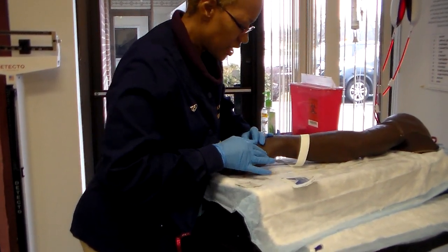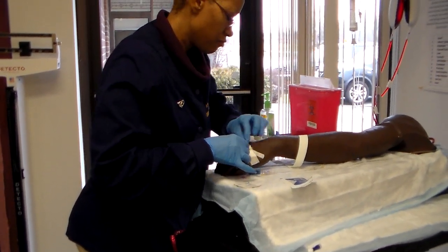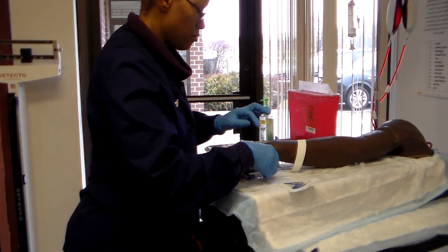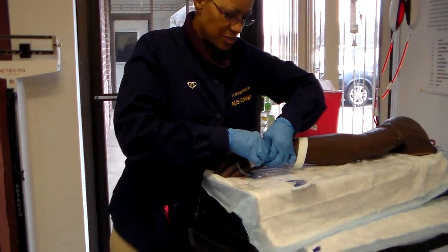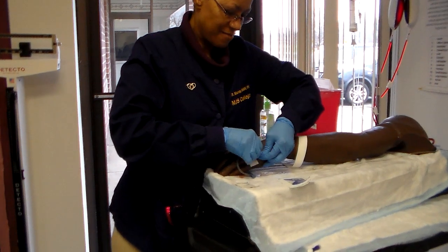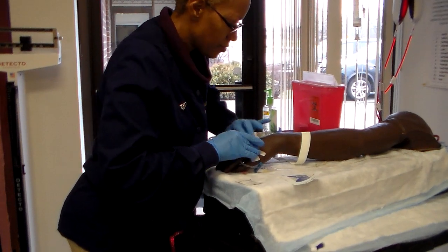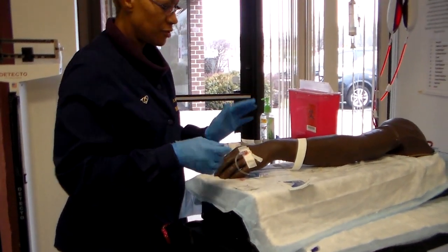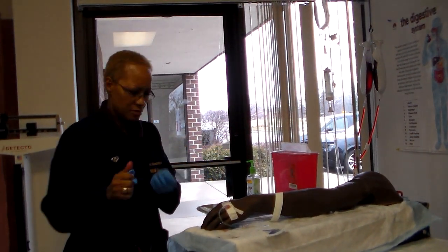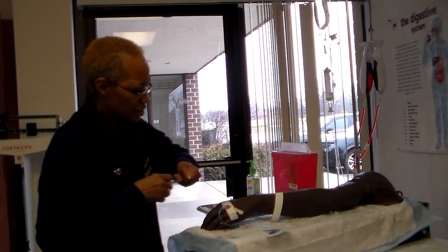You're going to find the tape is not going to stick very good to the mannequin. It's kind of long. Don't fool around and pull it out. Okay, maybe I'll use my scissors. I don't know why the tape isn't sticking here. Hold on, let me get my scissors. I want to cut it down. Can't stand for that to be that long.